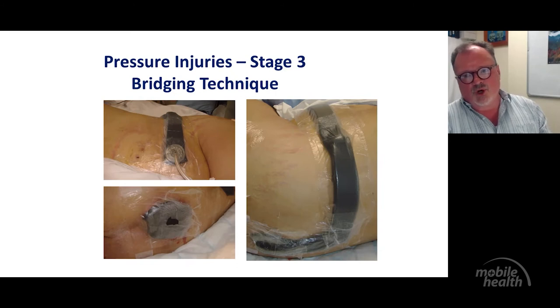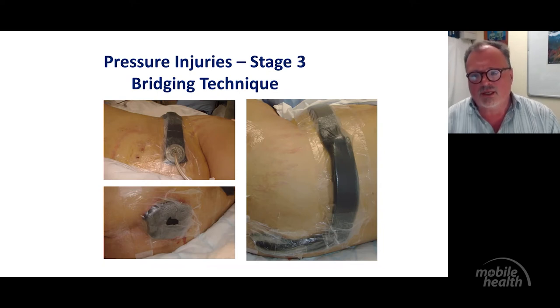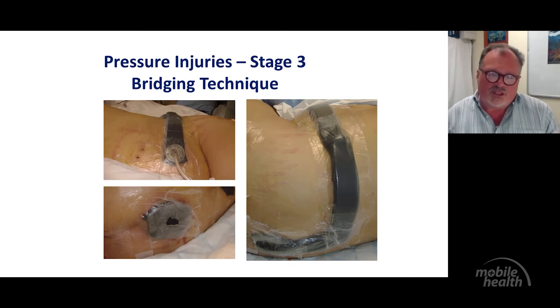When you use the foam, obviously, you need to also ensure that the foam is not sitting on the skin, so it's covered by a barrier. We usually use a thin hydrocolloid film, or you could use the drape. Otherwise, the foam is a bit harsh, it excoriates the skin, it's painful, and it looks like a burn.